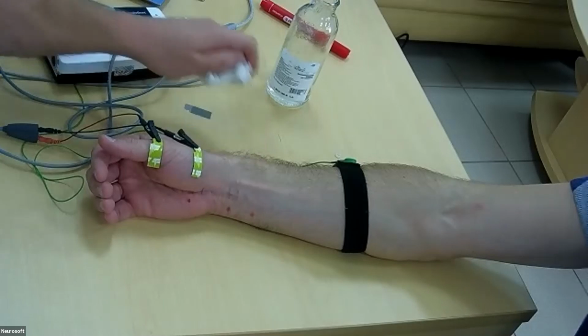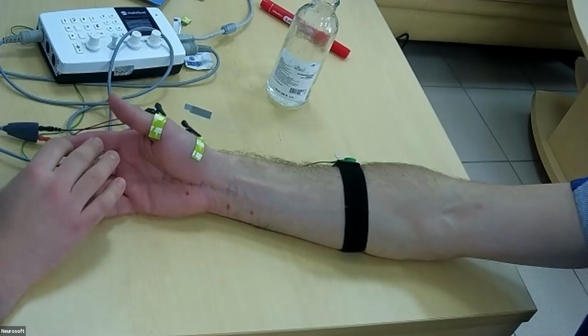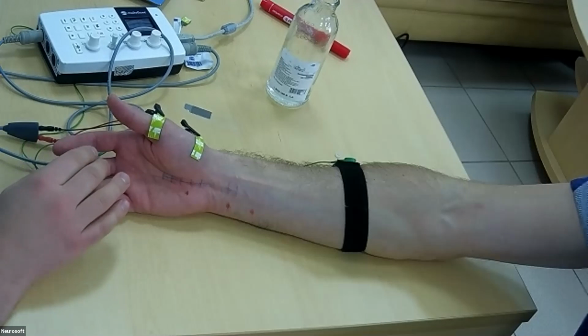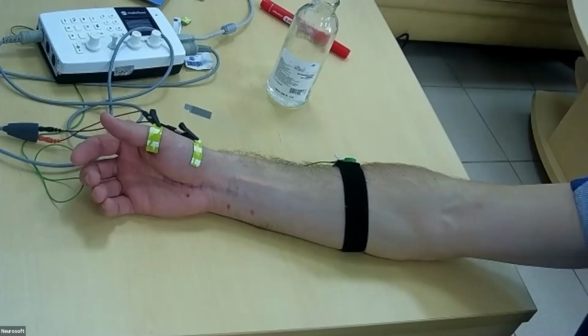method. So we will use the cutaneous silent period. It's a method which is connected with small nerve fibers.